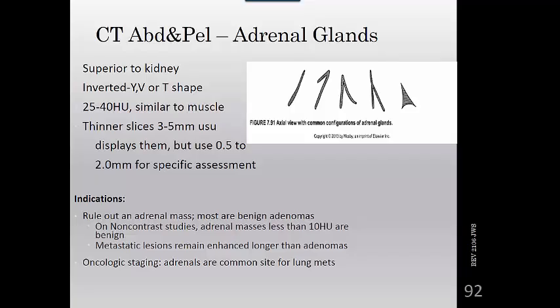And secondly, the CT has gained widespread acceptance as a technique of choice for differentiating adrenal adenomas, which are benign adrenal masses, from metastasis. The characterization of adrenal masses is accomplished by assessing their attenuation values and by evaluating the degree of IV contrast that washes out of the mass on delayed imaging.